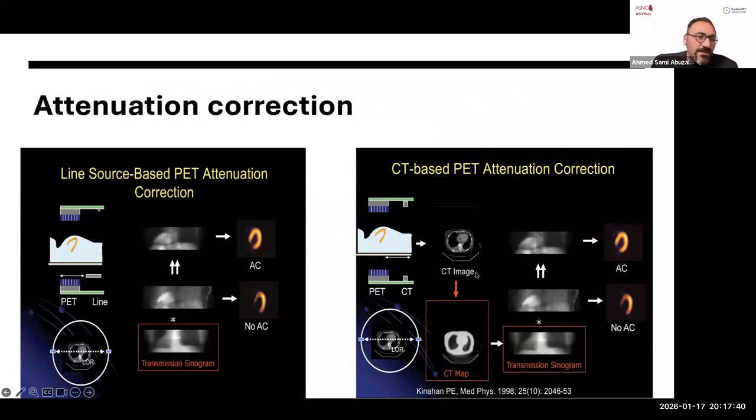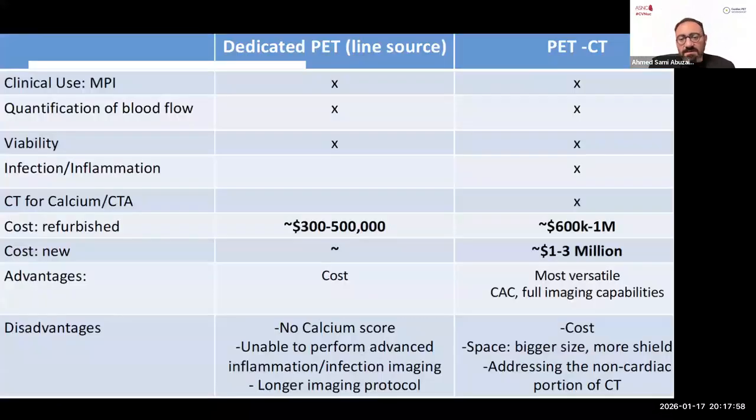And we have a lot of centers who are doing cardiac PET without CT, and they have great turnaround and they have great image quality. So I think understanding attenuation correction and how you do it in your scanner will help when we think about understanding artifacts or not.